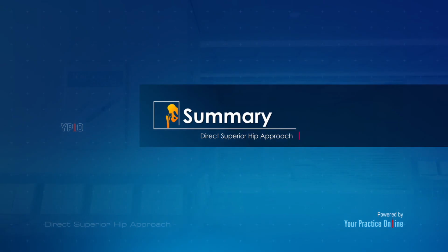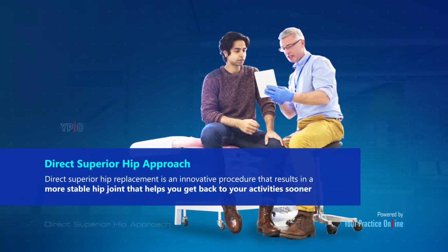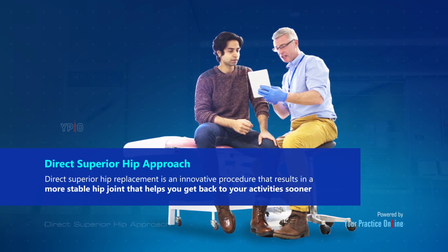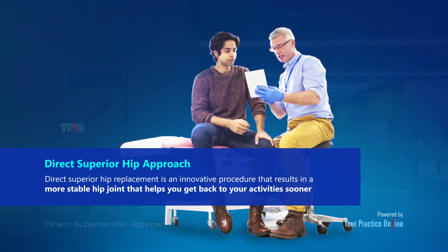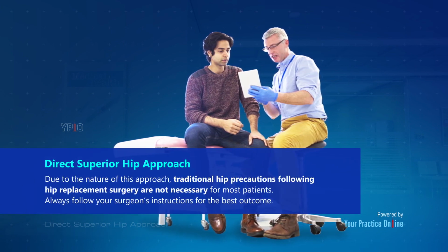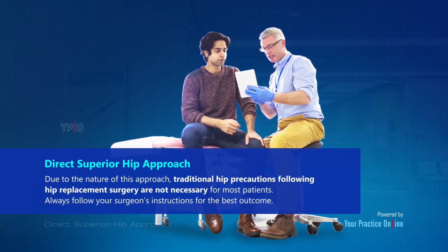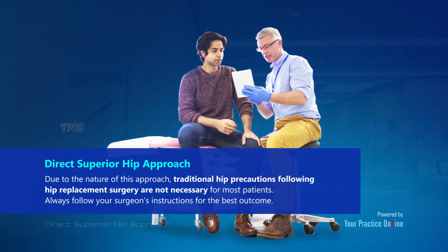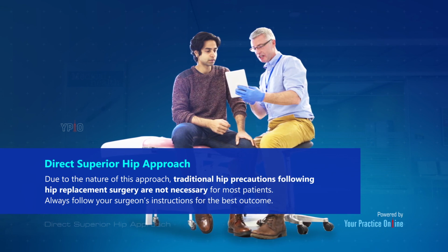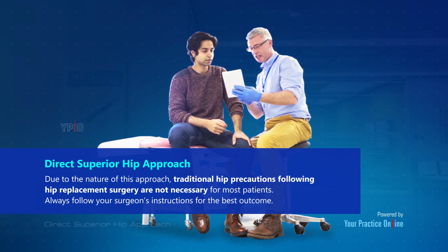Summary. Direct superior hip replacement is an innovative procedure that results in a more stable hip joint that helps you get back to your activities sooner. Due to the nature of this approach, traditional hip precautions following hip replacement surgery are not necessary for most patients. Always follow your surgeon's instructions for the best outcome.